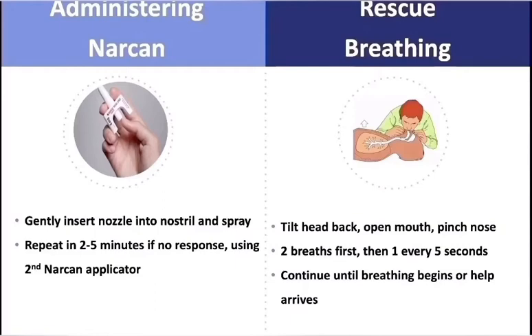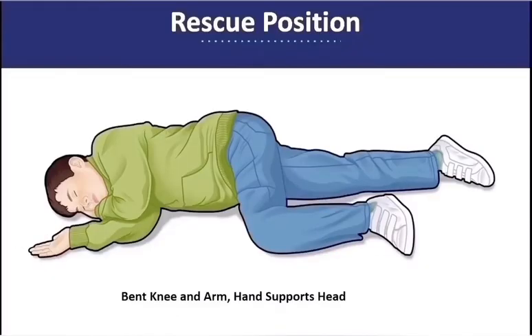until they begin breathing on their own or help arrives. If the person is not revived within 2 to 5 minutes after the first dose of Narcan, use a second applicator in the rescue kit to deliver a second dose of Narcan. This can be done in either nostril. Continue rescue breathing as necessary. Place the person in the rescue position shown here as soon as you can. The position will keep their breathing passages open and keep them from aspirating if they vomit.